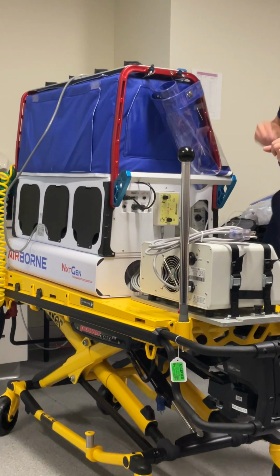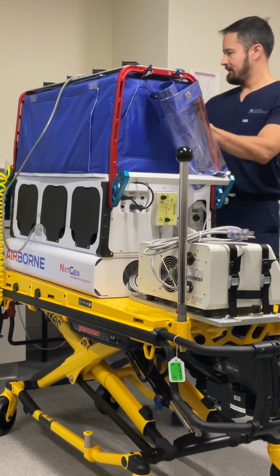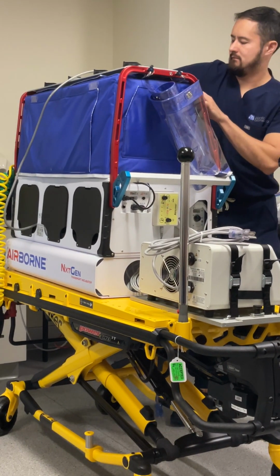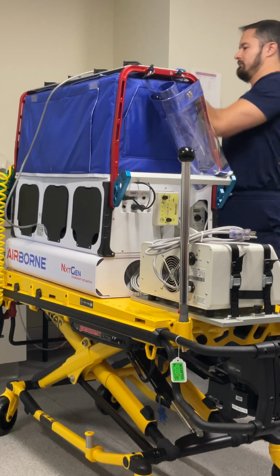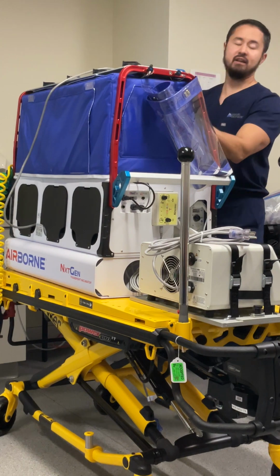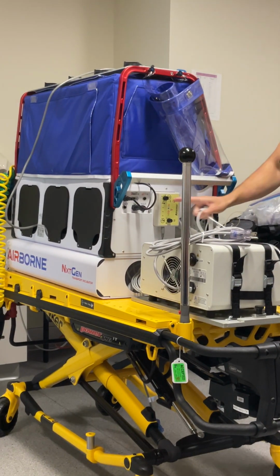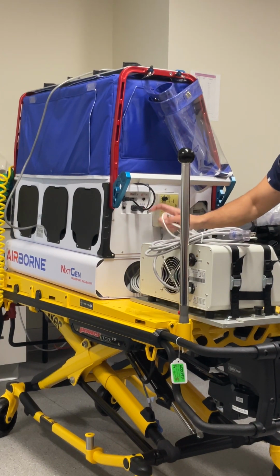The monitor one will always be plugged in. The extra one, if you need a pre and a post, will be in the blue bag probably, but it's separate. It's not the same connection. Like our original connection? No, the connection on the baby end is fine. The connection to the Isolette is not. They're different prongs.